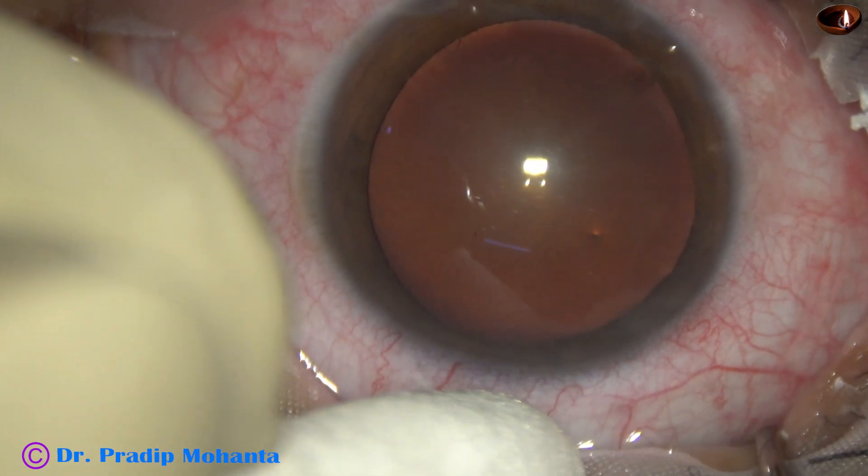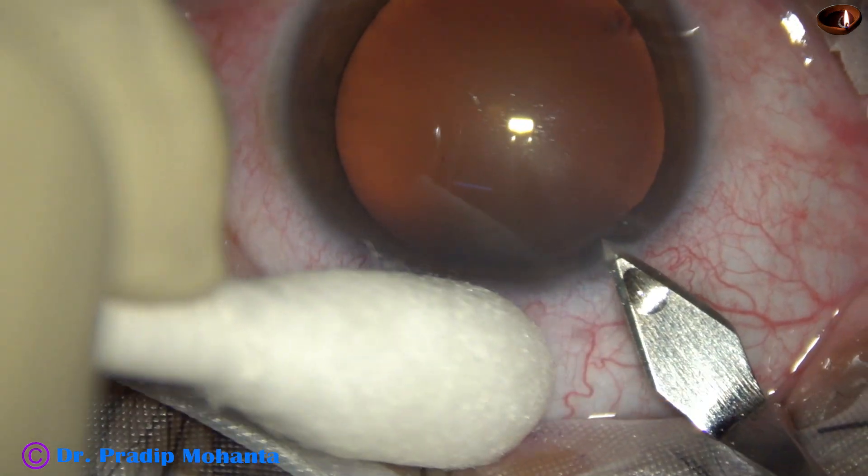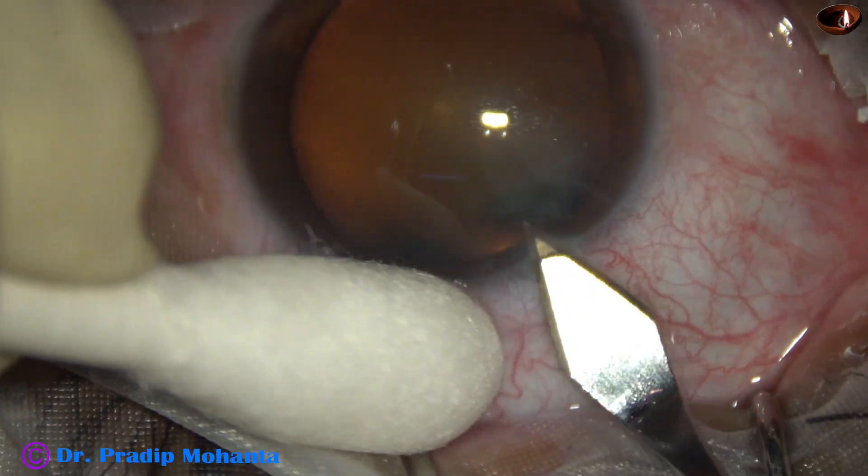The patient is under topical anaesthesia. This is the main incision with a 2.8 millimeter steel keratome.